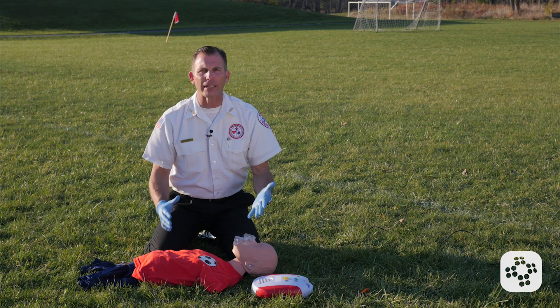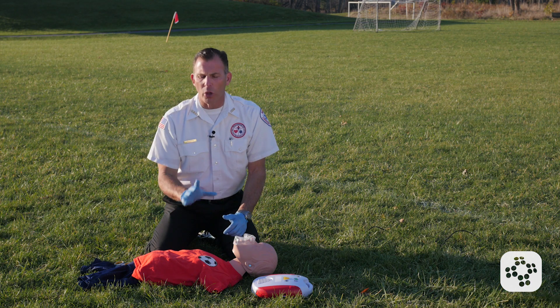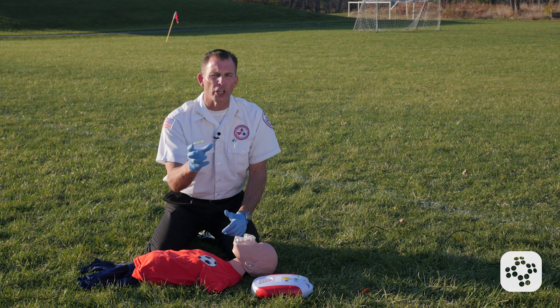When the AED arrives on scene, the very first thing that we do is we turn it on. There's one thing we need to note though, and that is there are sometimes two different size pads in the AEDs — one's for adult and one's for infants or children.